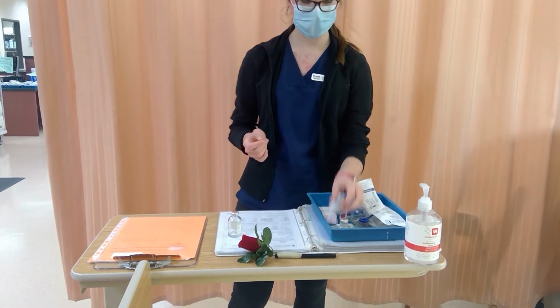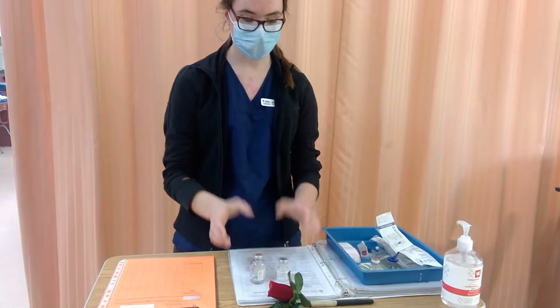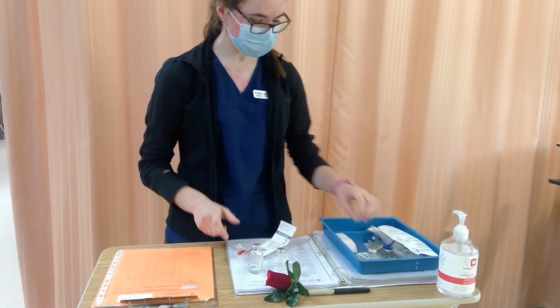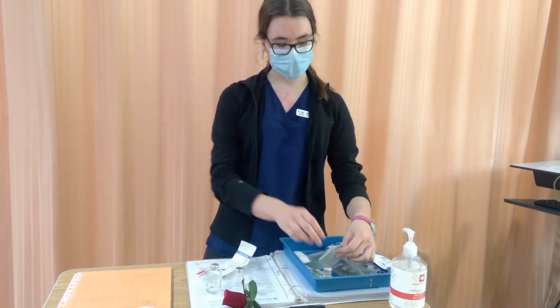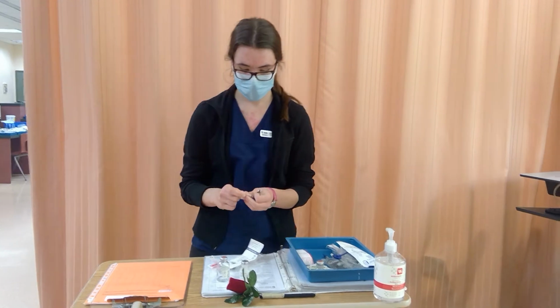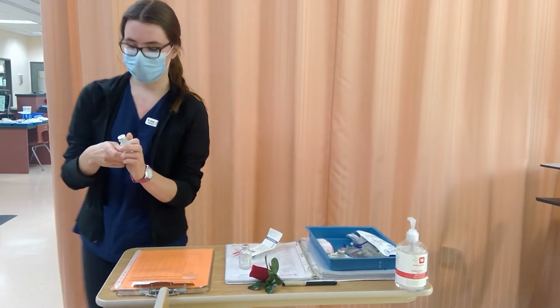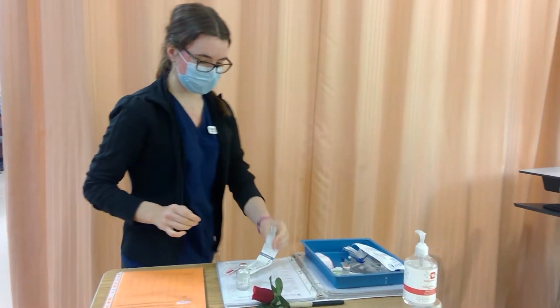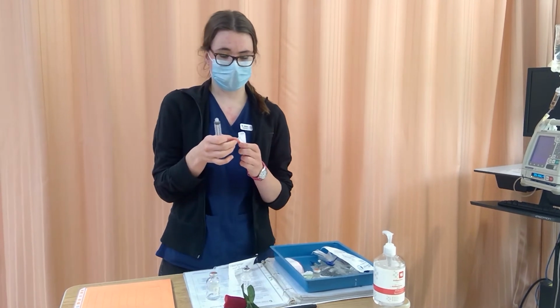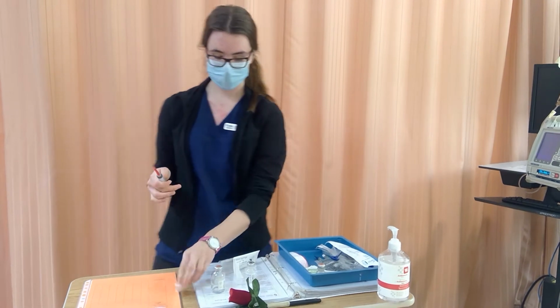So now I'm going to start my reconstituting. I see sterile water, and it's not expired, and I see this is also not expired, so we're working with good medication. I'm going to grab my 10 ml syringe and a blunt fill needle. I'm going to take my alcohol swab and swab the top of my sterile water for 30 seconds, and then let it dry for 15. Then I'm going to take my 10 ml syringe and my blunt fill needle and attach those without contaminating either of the hubs.